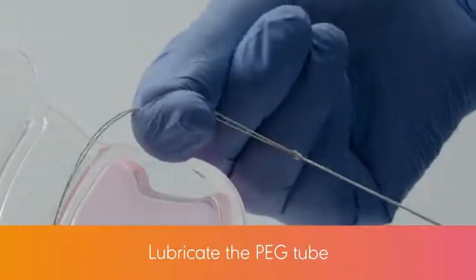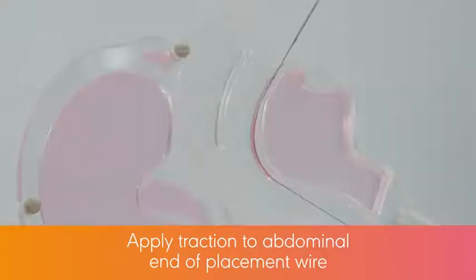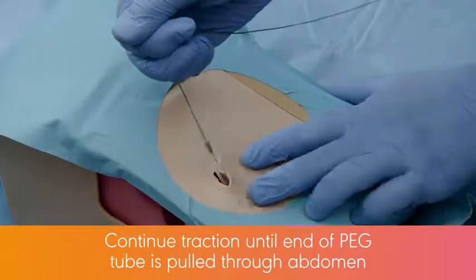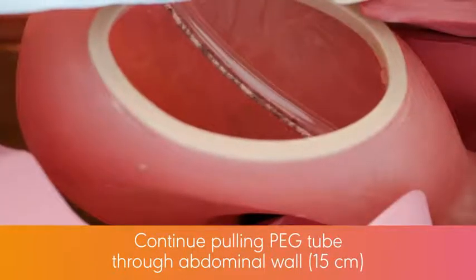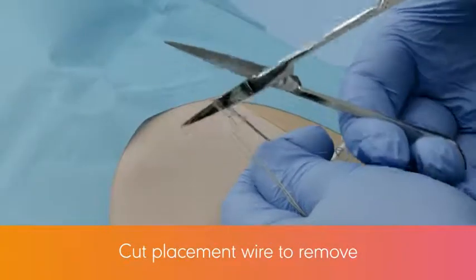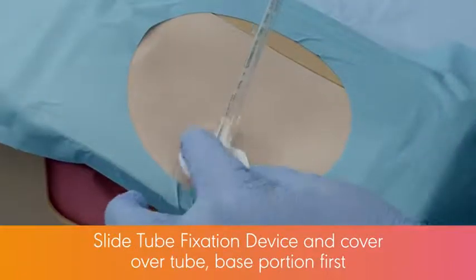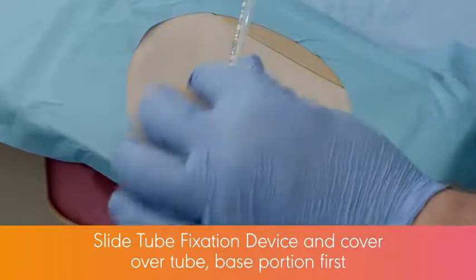Lubricate the peg tube. Apply gentle steady traction to the abdominal end of the placement wire while guiding the peg tube into the patient's mouth. Continue traction until the end of the peg tube is pulled through the abdomen. Continue pulling the peg tube through the abdominal wall until the 15 cm mark on the tube is visible. Cut the placement wire to remove it from the wire loop on the tube, then slide the tube fixation device base and the tube fixation cover over the entire tube.